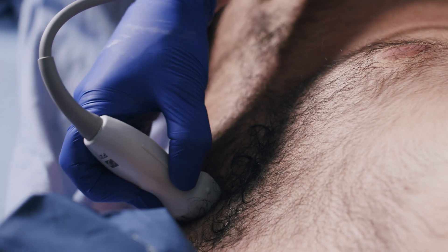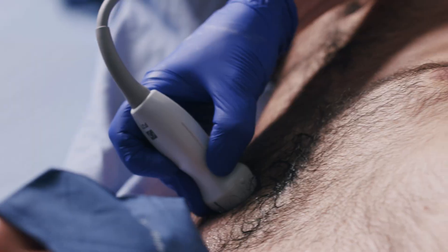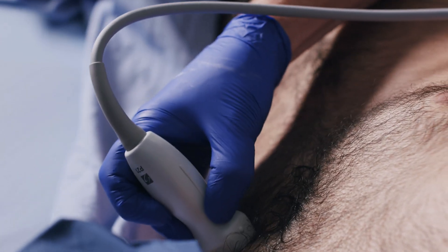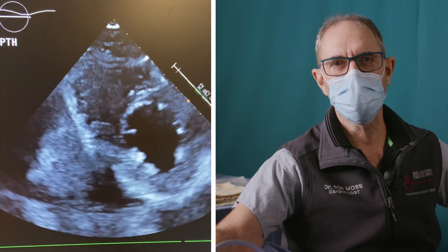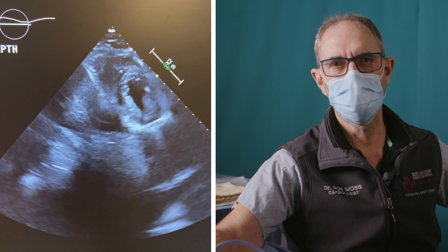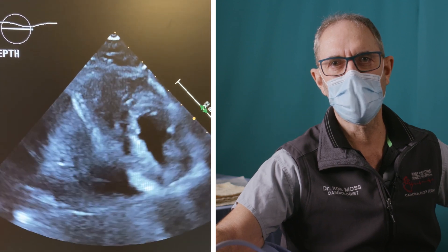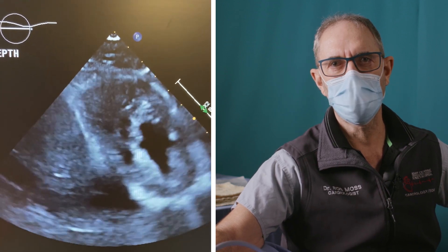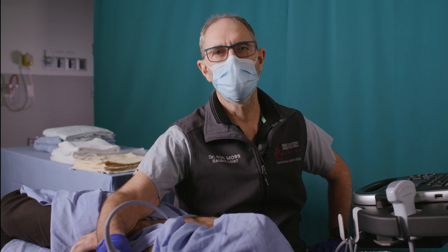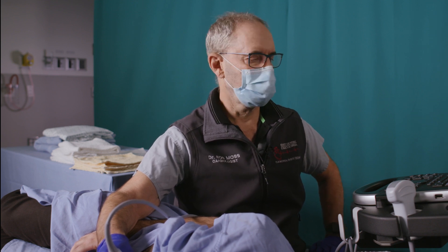You may need to tilt or slide laterally or caudally to obtain the correct image. Adjust the depth setting so the left ventricle is fully displayed at the bottom of the screen. Adjust your gain so the blood pool is black but you can see the endocardial structure. Once the image is optimized, acquire the image.